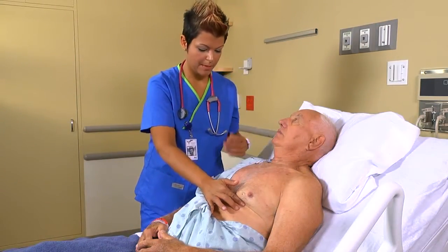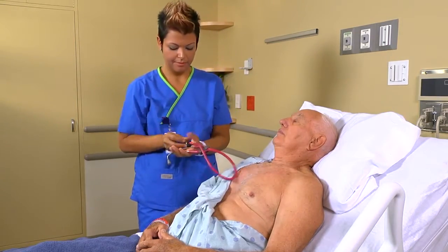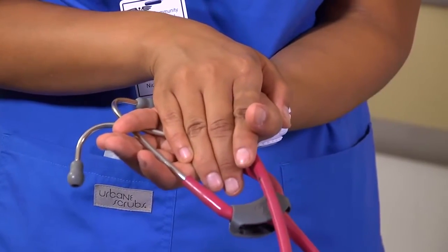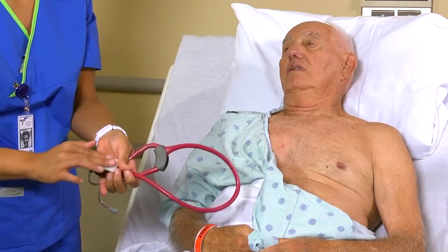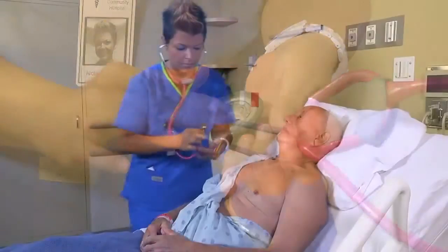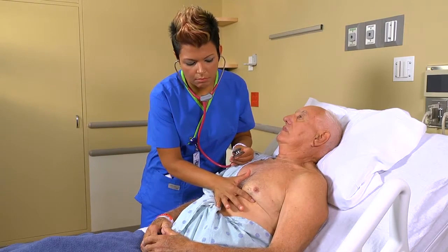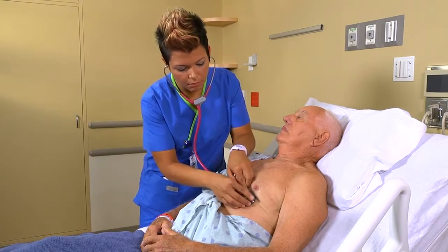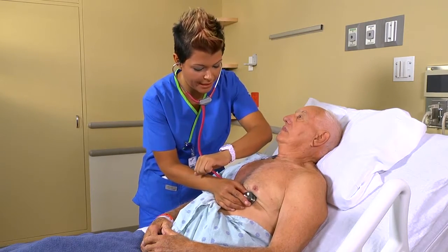Now that I've found the spot, I'm going to go ahead and take a listen with my stethoscope. Warm the diaphragm of the stethoscope in the palm of your hand for five to ten seconds. Then clean it with alcohol and allow it to dry for 30 seconds. Place the warmed diaphragm of the stethoscope over the PMI and auscultate the normal S1 and S2 heart sounds — lub-dub, lub-dub.